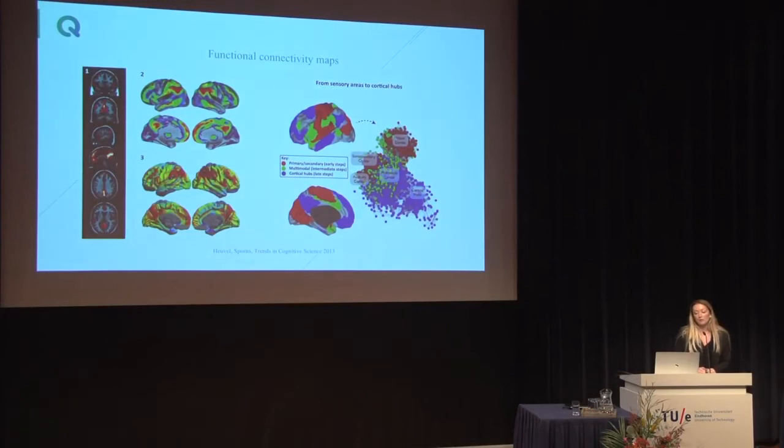When we talk about functional connectivity maps and visualization in functional connectivity, there's not much state-of-the-art here. This is something that over 10, 15 years has been standard in the field. Normally, like you see on the left side, activation maps are overlaid on a template, or in 3D, also on a template brain, which is kind of inflated. These kinds of studies are rarely done at the individual level; normally they are done at a group level where we want to compare patients versus controls for different groups of patients.